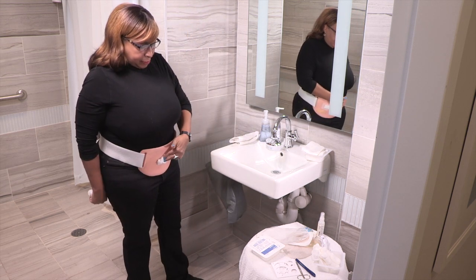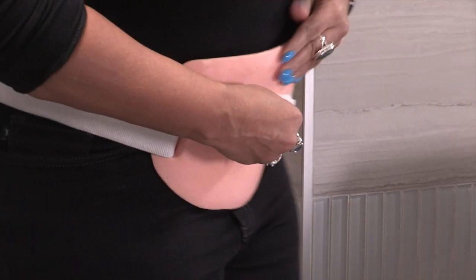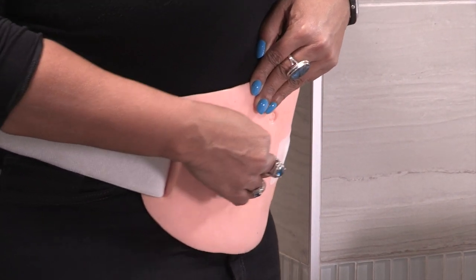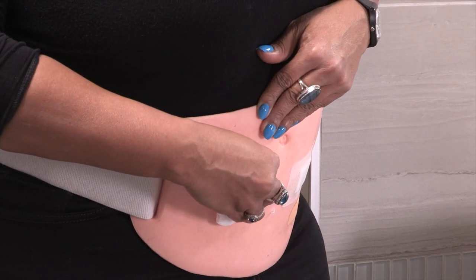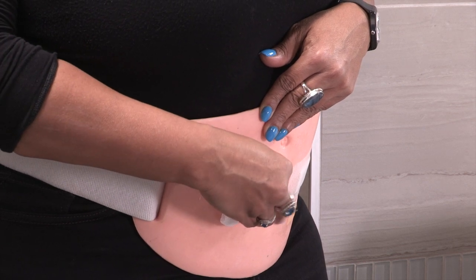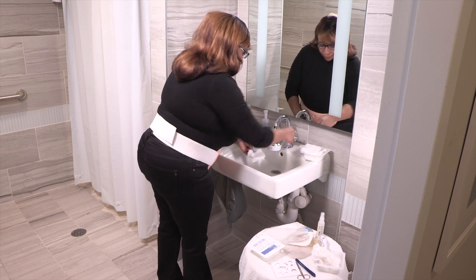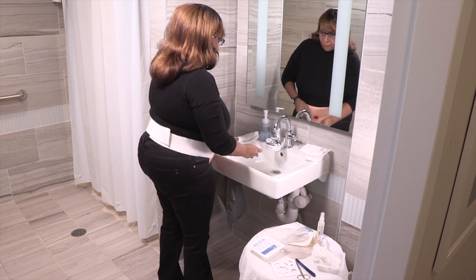Many people enjoy leaving their skin uncovered for 15 to 30 minutes after removing the pouching system. This is called a skin break. You can decide if you want to take one. If you do take a skin break, you can hold a towel, urinal, or other container over your stoma to catch the urine that leaks out. Next, moisten a piece of gauze, paper towel, or washcloth and use it to gently clean the skin around your stoma.